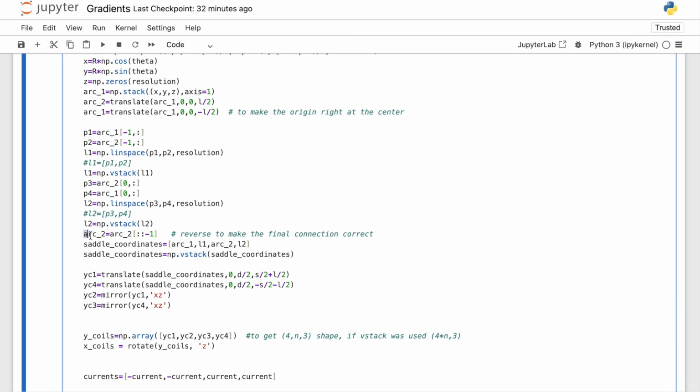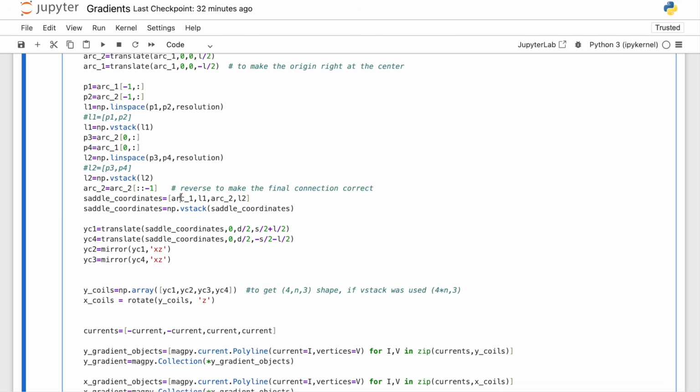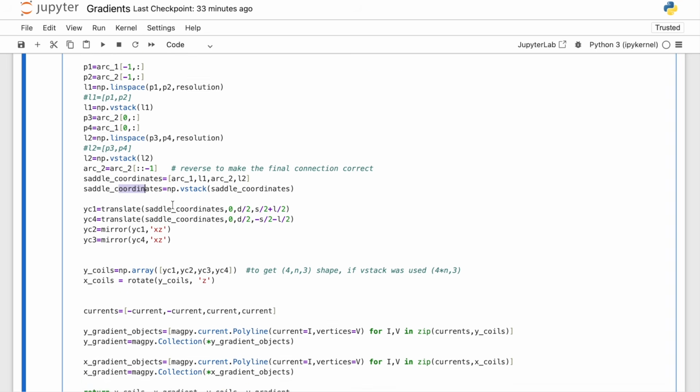And finally we reverse the coordinates of arc 2. Why? To make the final connection correct. What I mean by final connection is that the points should start and end at the same place. So we need to have a closed loop. So this achieves that. Then the base saddle coordinates are just a list of arc 1, line 1, arc 2, line 2. The order is important. The order defines the order of connections. So if the order is missed, there will be some intermediary undesired lines, which will mess up the simulations. And then to make a numpy array out of this list, I just use the vstack function.